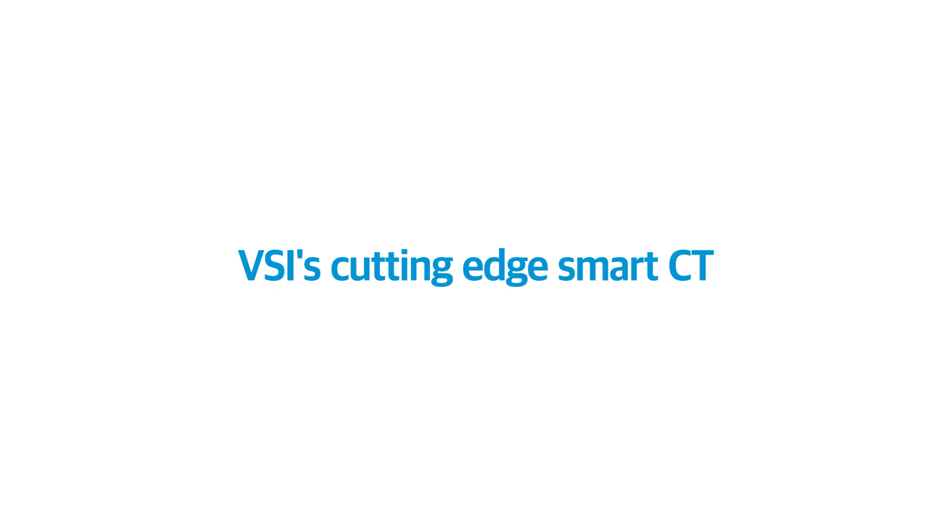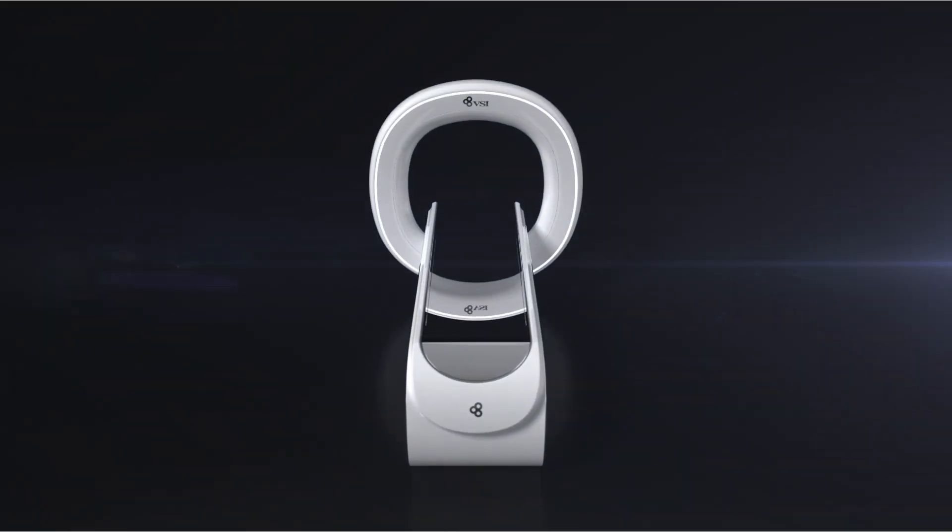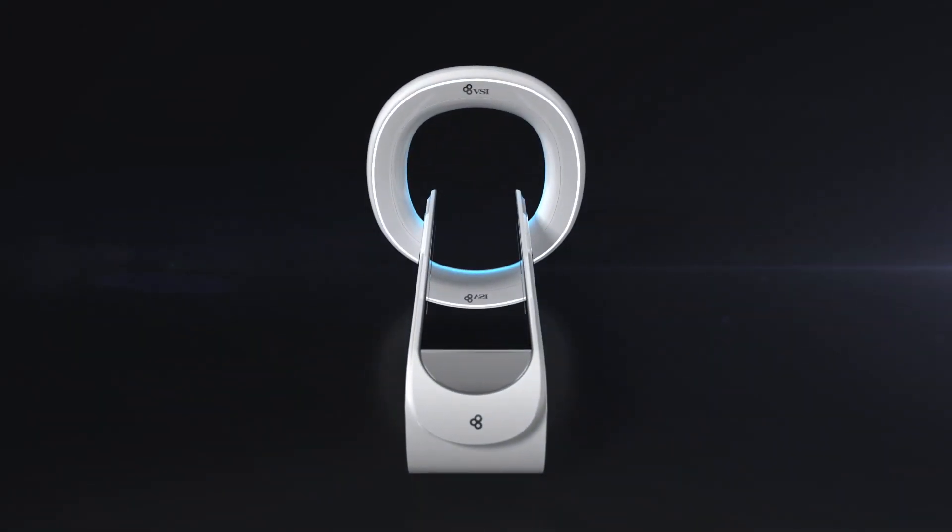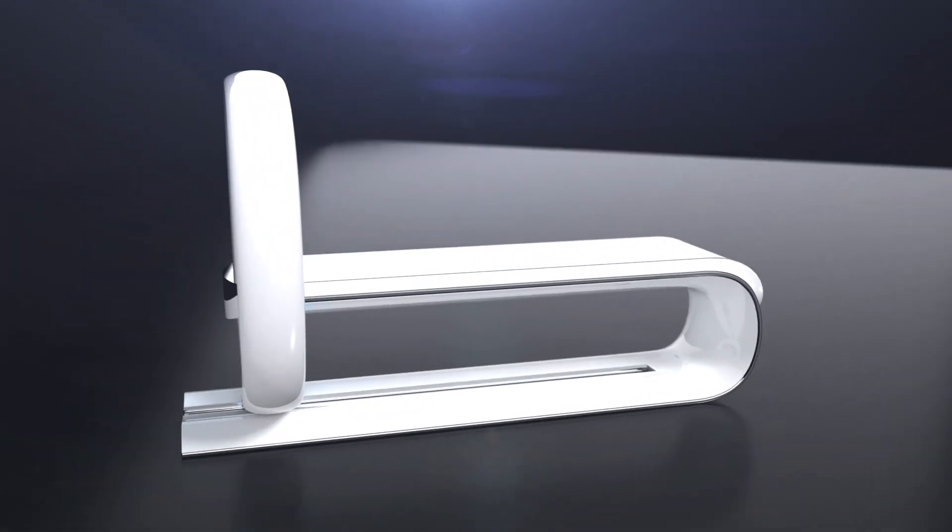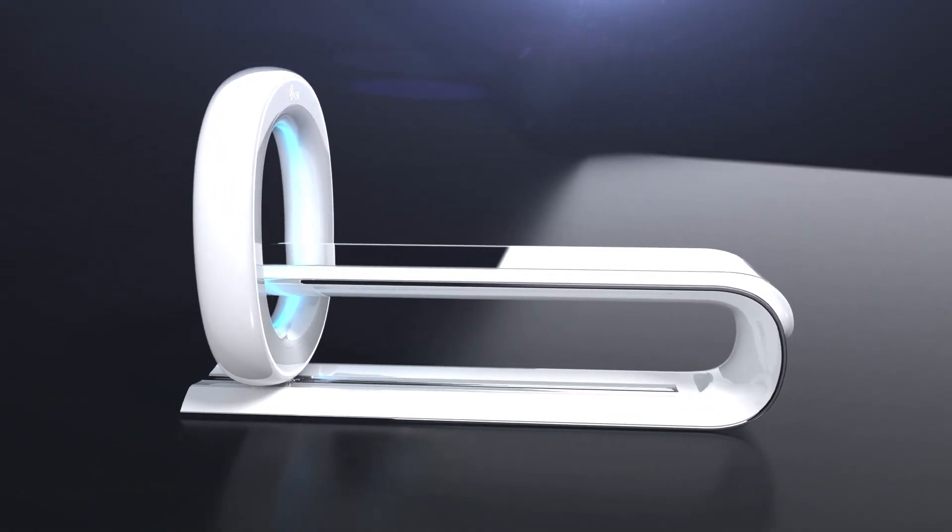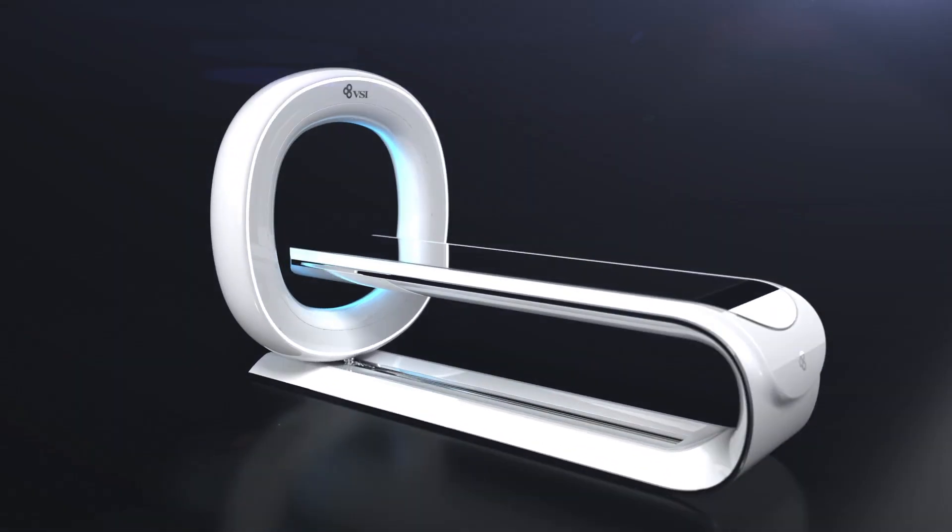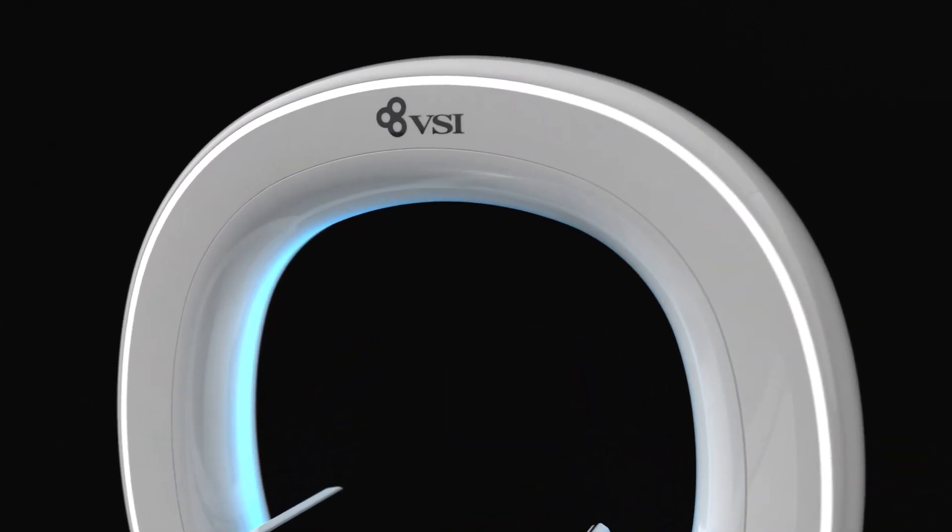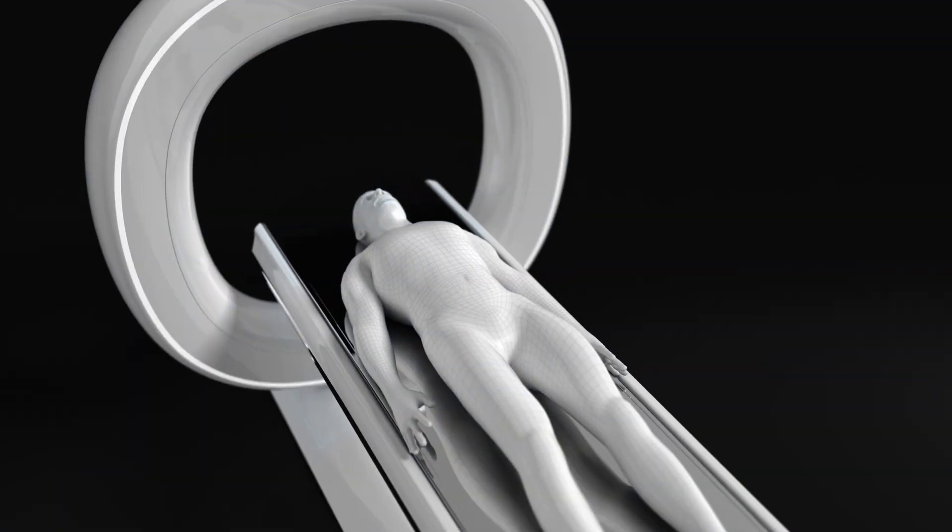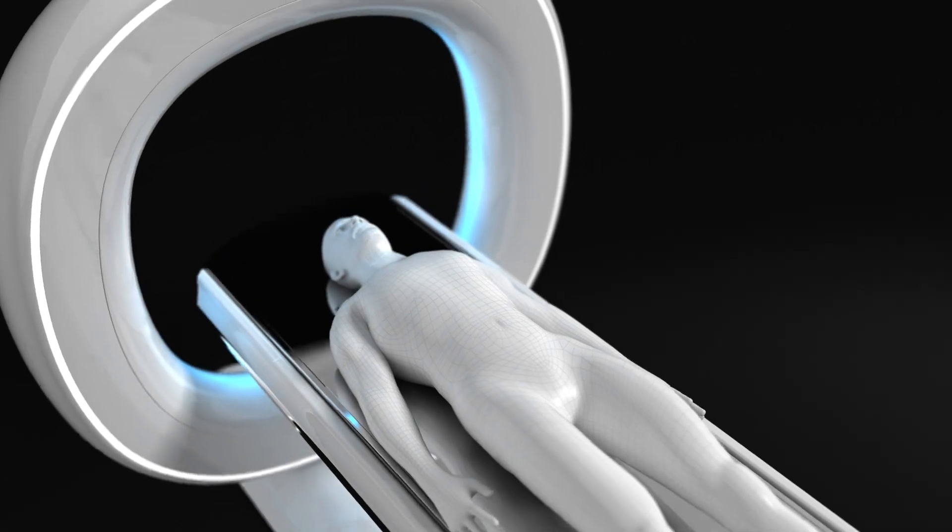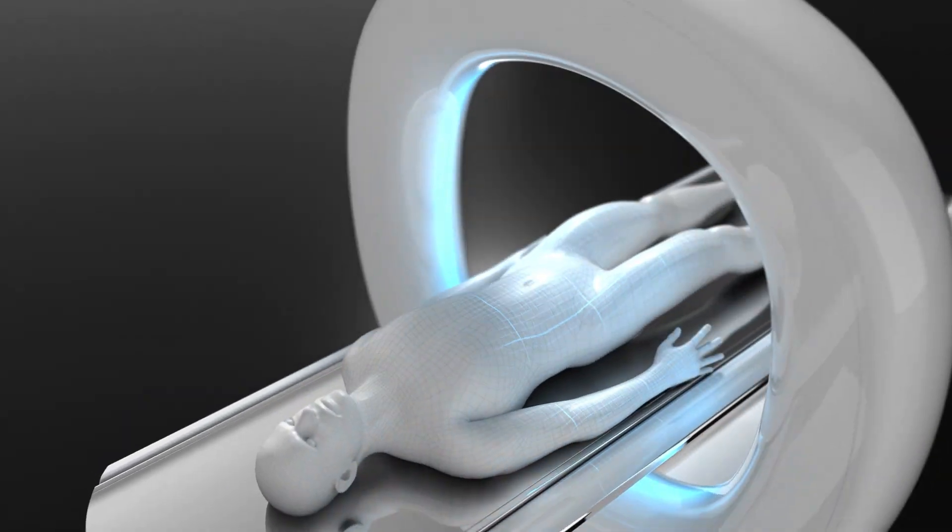Here is the cutting-edge smart CT of VSI. VSI CT is the state-of-the-art smart CT capable of faster and more precise image diagnosis while reducing expensive imaging cost and exposure.